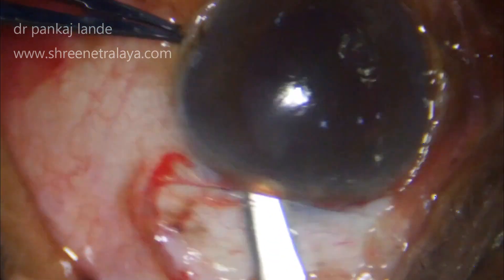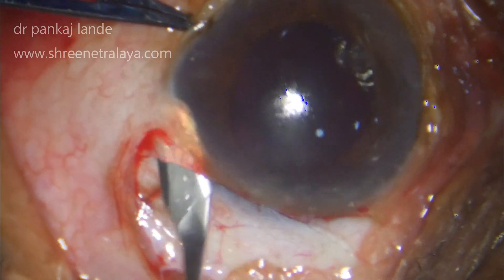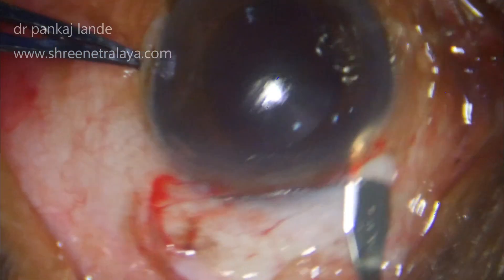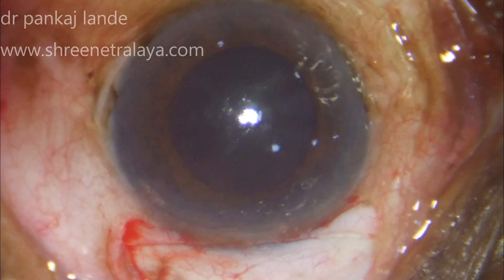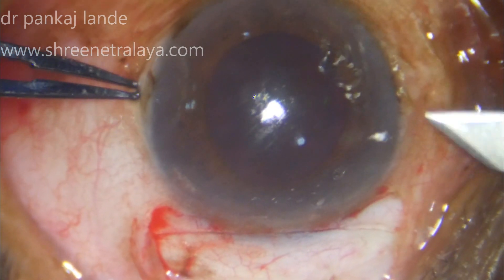The scleral tunnel should be partial thickness and uniplanar. If you have entered on one side, try to continue the same plane throughout the tunnel and make a good scleral pocket so that while removing the nucleus, you have enough space for the nucleus to come out.